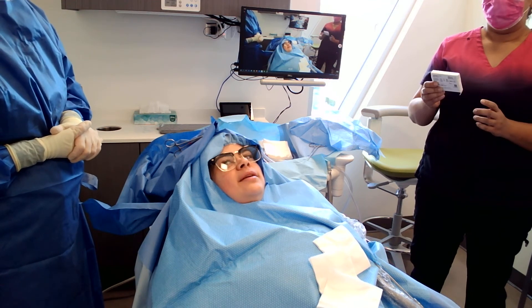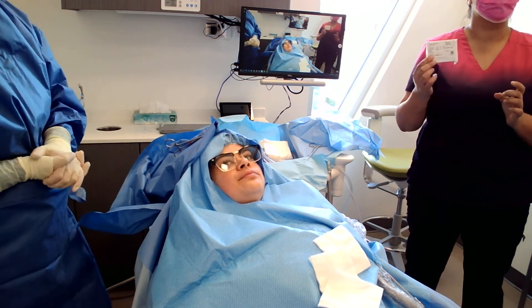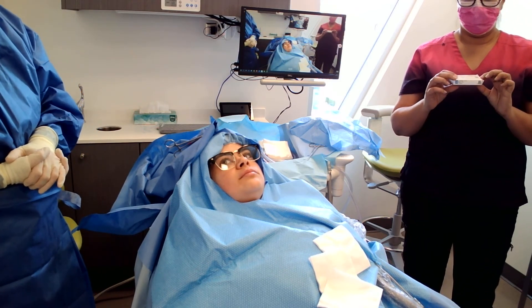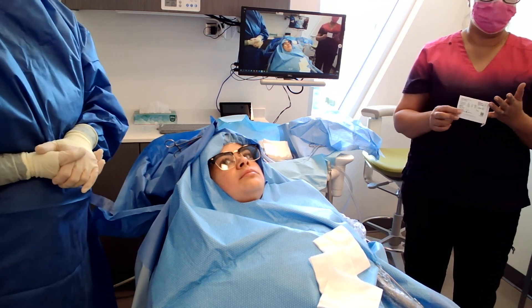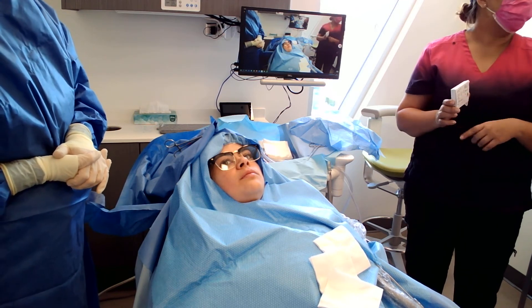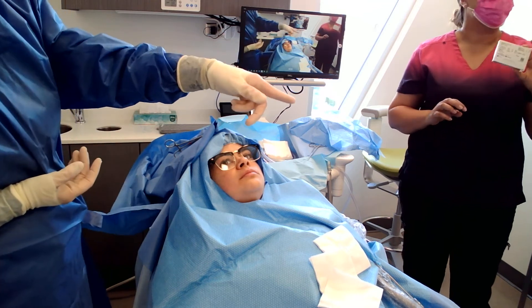I think we've covered everything. When you've got your implants, have them leave the packaging in the room — there's a lot number and everything that needs to be recorded in your clinical charting. Some will have a little sticker on the inside that you stick onto a paper chart or scan into their file. You want to make sure you've got the lot number and all the information recorded in your clinical notes on top of everything else you've used. It also tells them the size, so when they come back for subsequent implants, you can refer back to it.